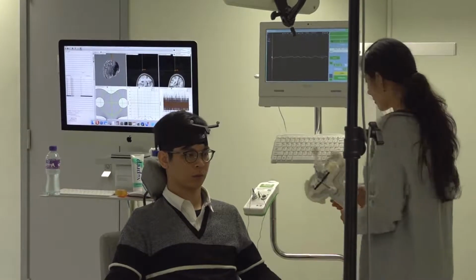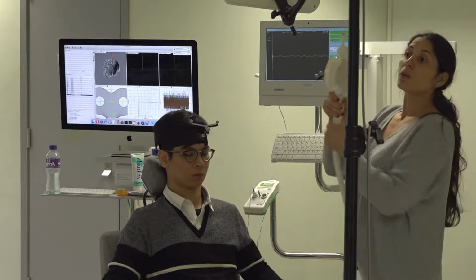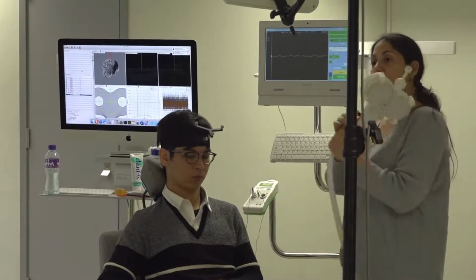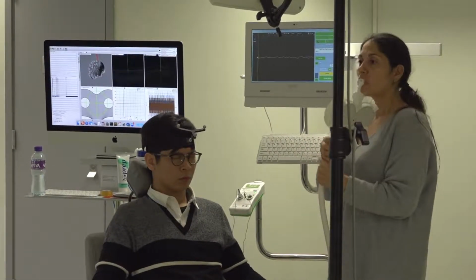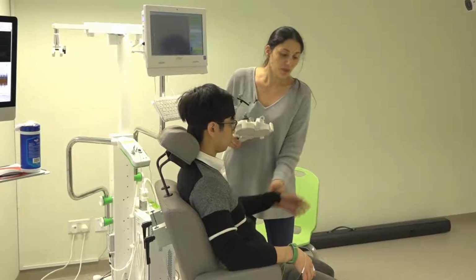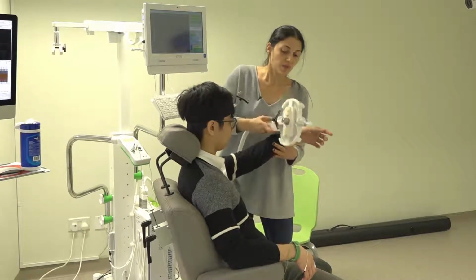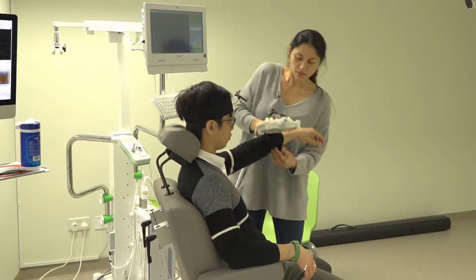Okay, let's try. Sorry, let's TMS him. Very cool, which I don't have in the equipment I'm working with. You can change the stimulation level from here. So when you have your subject, before applying the stimulation, you can tell him, okay, we are going to stimulate, this is going to feel like this, and then you show him how it's going to feel.